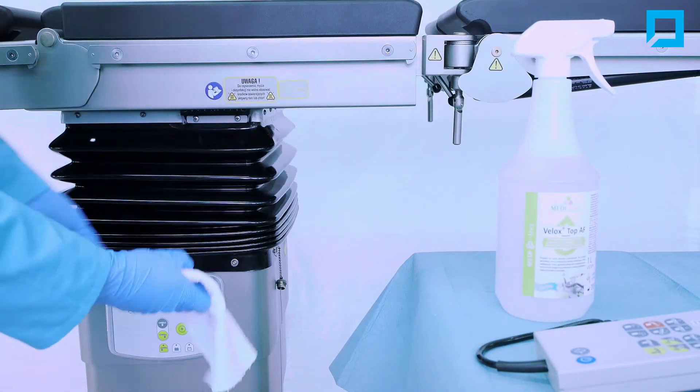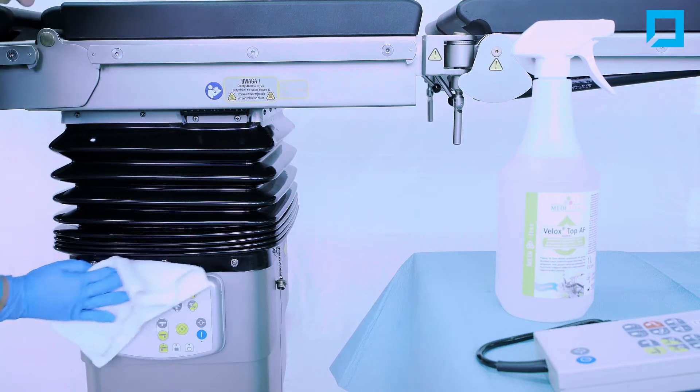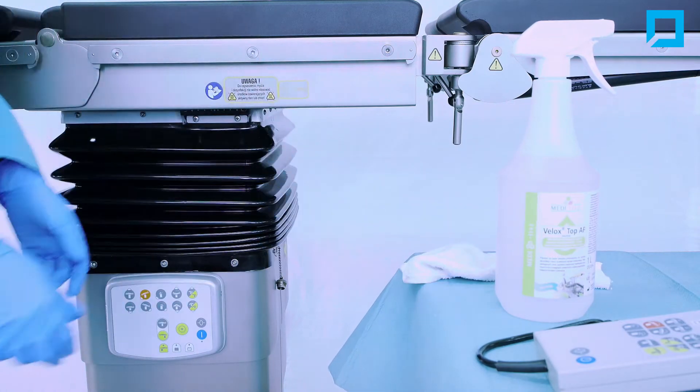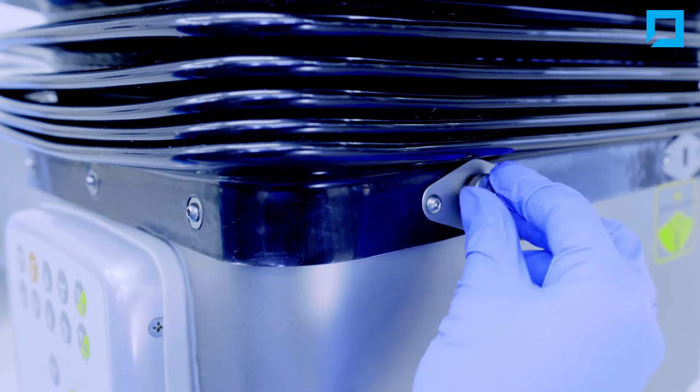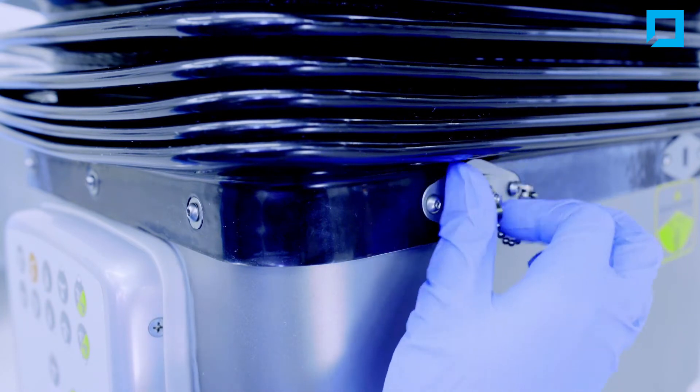Disinfect the control panel with disinfecting liquid or alcohol wipes. Screw in the protective cap on the remote control socket to stop any liquids from getting inside.